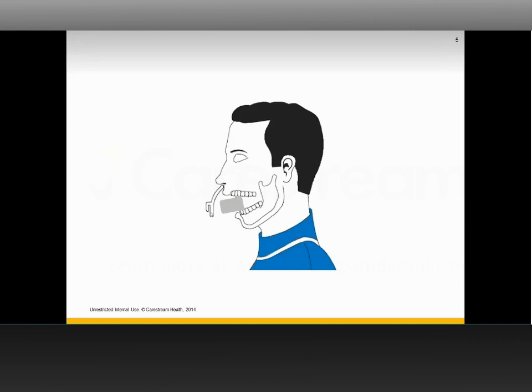Excellent. And as can be visualized here, we've got the bite block in. We show the specific control here for a TMJ. What's not visualized is the temple clamps, and the possibility to add a head strap if necessary. And of course, as with all of our cone beam CT, the patient can be sitting or standing.